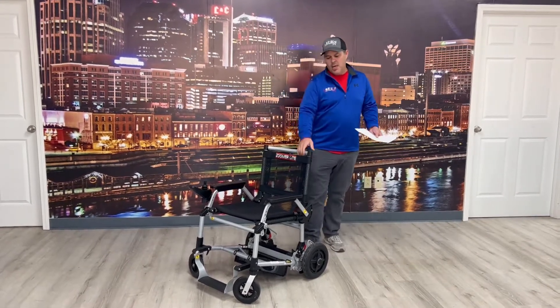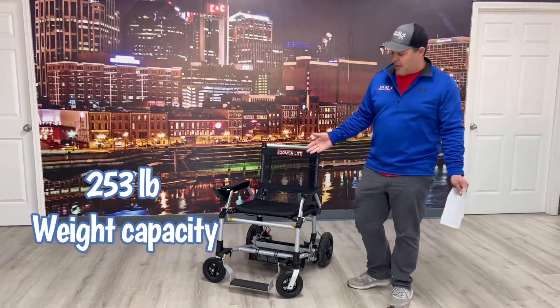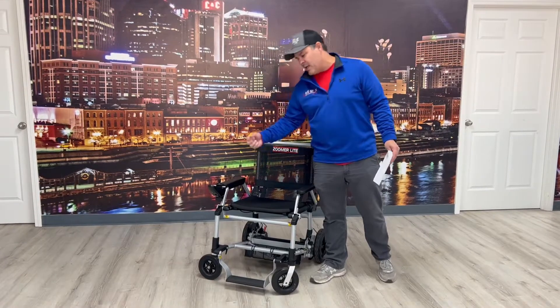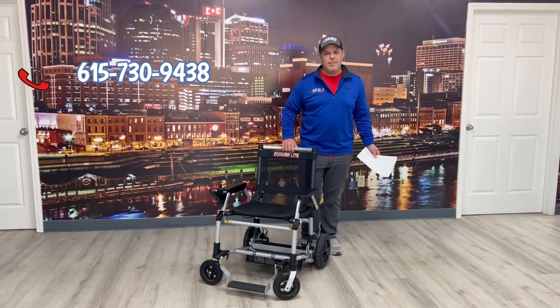This chair has a 253-pound weight capacity. You've got a remote joystick that you can put on either side — right or left. It can come off for easy transportation purposes if you're traveling, so you don't have to worry about damaging it.